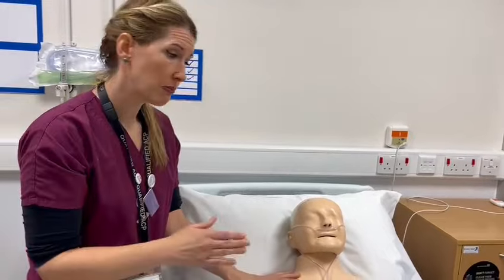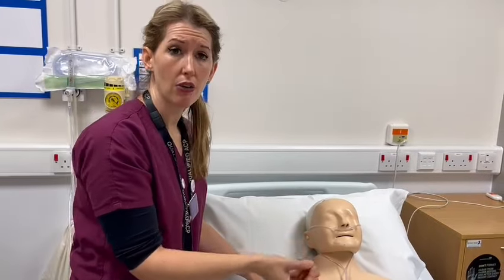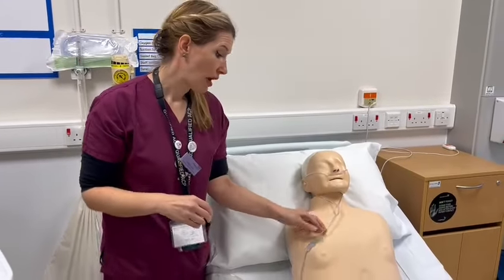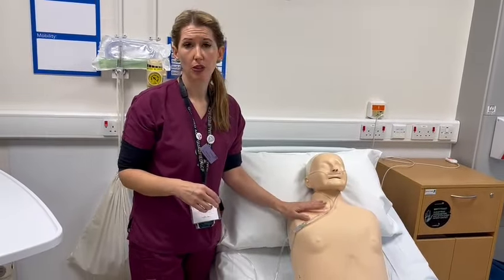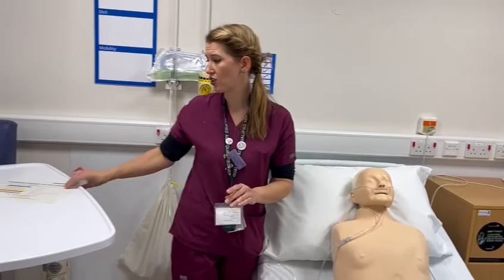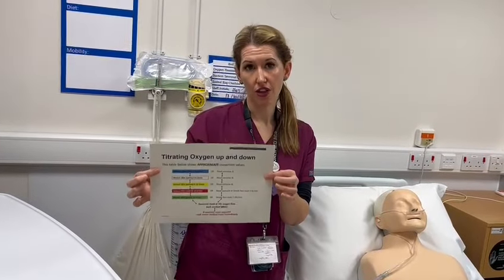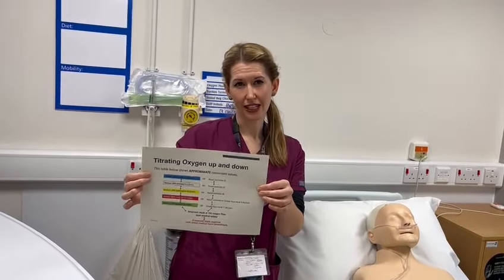Once I've made that change, just because things can change, I would then go and check that their SATs are within their target range as predicted. The flow rate can go up to probably about 6 litres. But you do have this flow chart to prompt you if you are worried about the conversions, which you will find on your machines. Thank you.